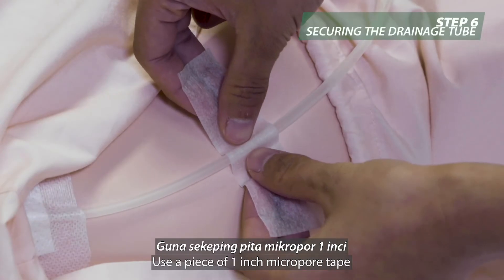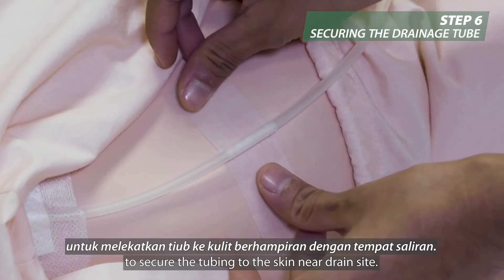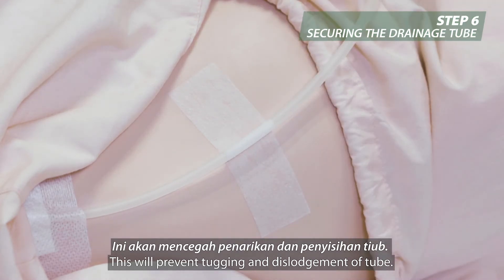Use a piece of 1-inch micropore tape to secure the tubing to the skin near the drain site. This will prevent tugging and dislodgement of the tube.